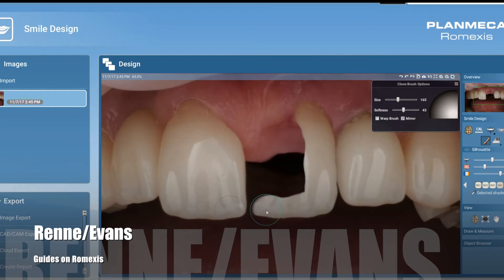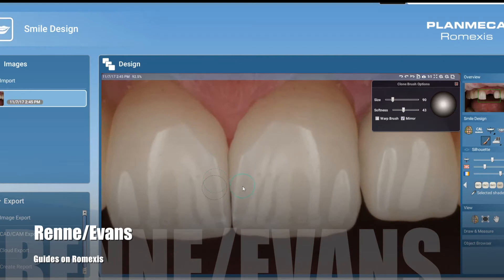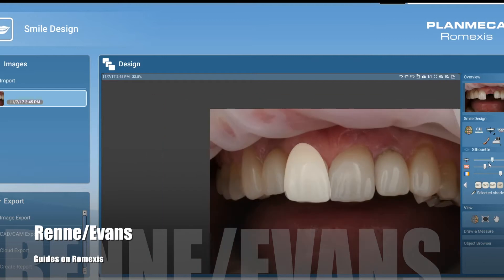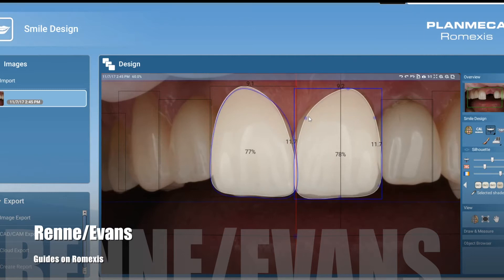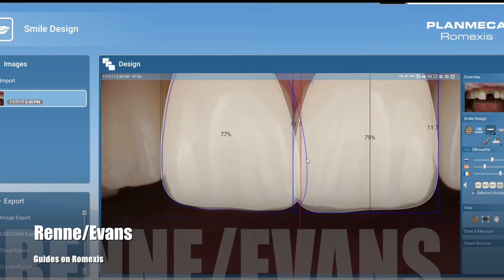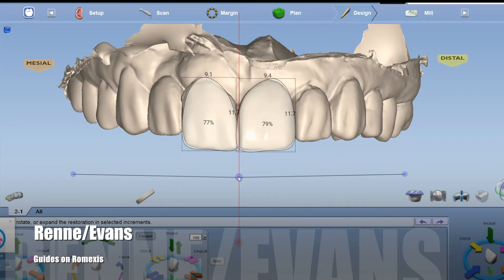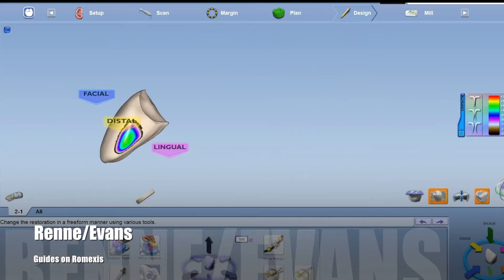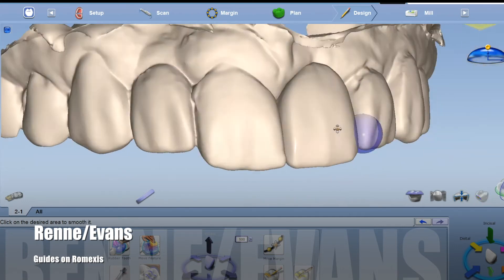Here I'm throwing it into smile design and using the clone feature. When you clone that tooth, you see there's about a half a millimeter diastema there. I'm going to mirror that area to show the patient that it might be a little bit wider. I can show it to her in her smile as well. Bringing it into the design software confirms it's going to be about a half a millimeter wider than ideal. In this instance, she didn't seem too concerned, so we're okay with that.